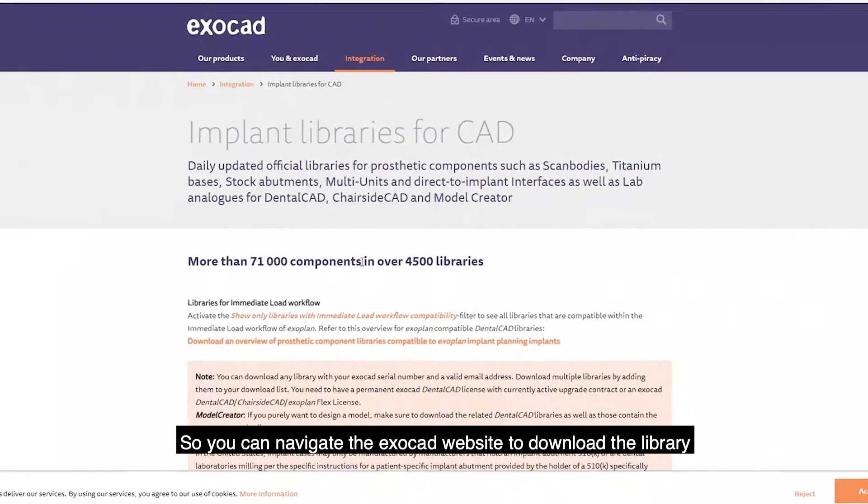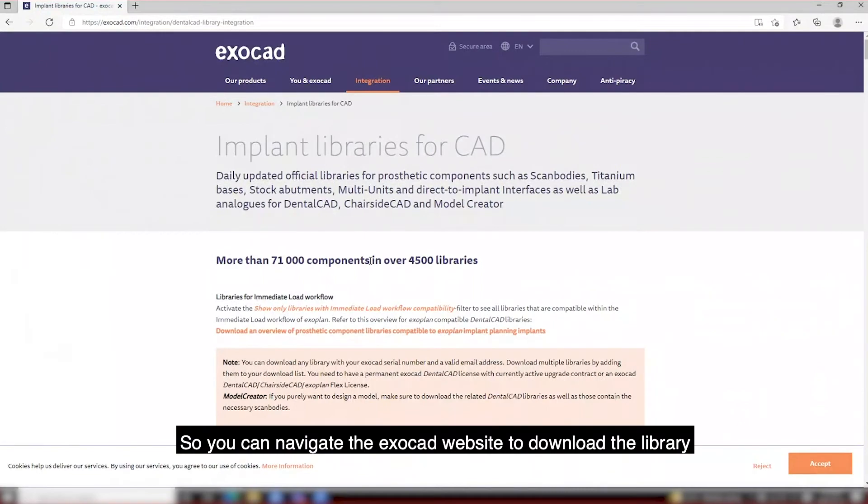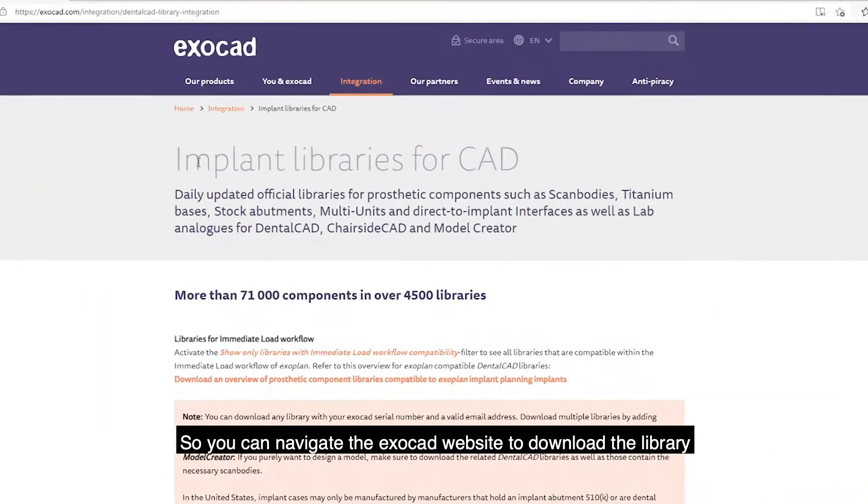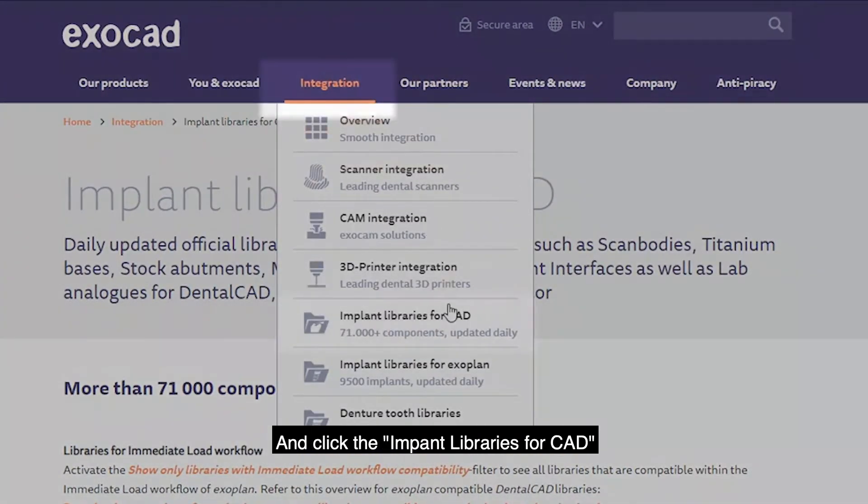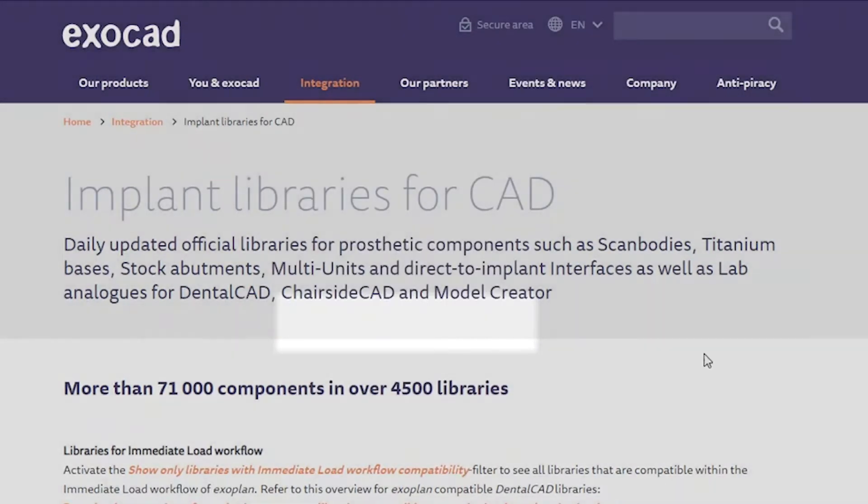You can navigate to the ExoCAD website to download the library. Go to integration and click the implant libraries for CAD.